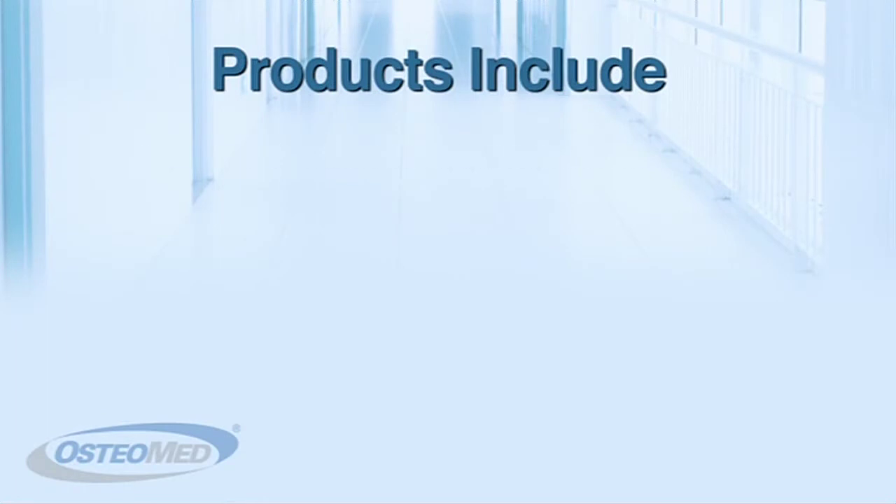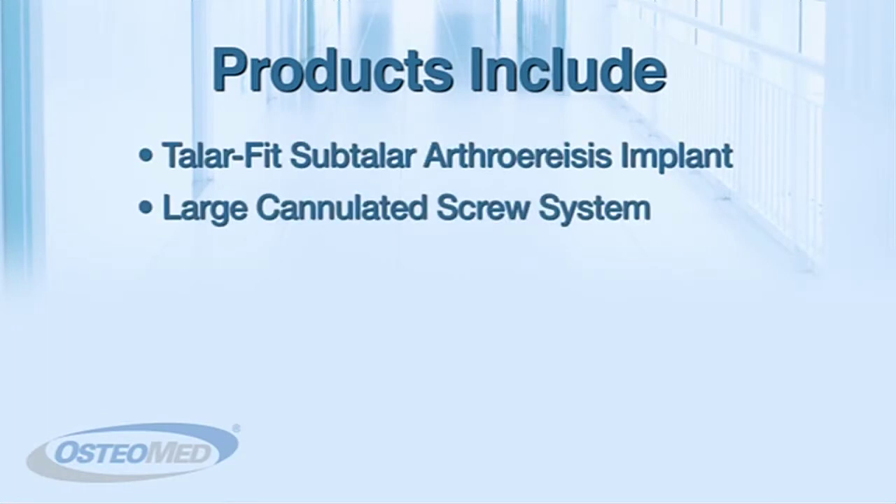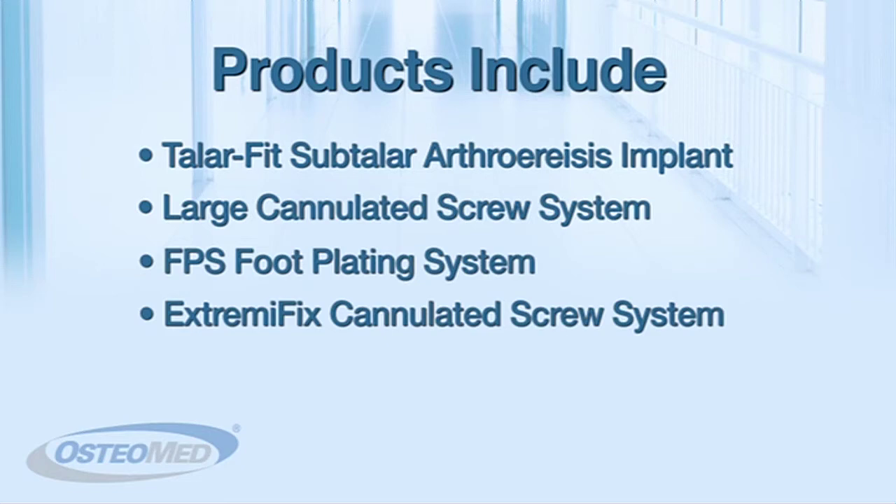These products include the TaylorFit subtalar arthroresis implant, the large cannulated screw system, the FPS foot plating system, and the ExtremaFix cannulated screw system.